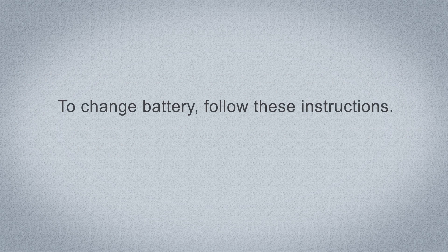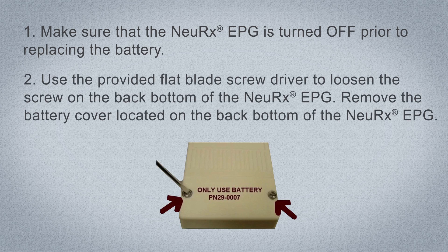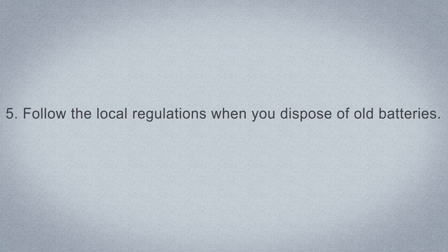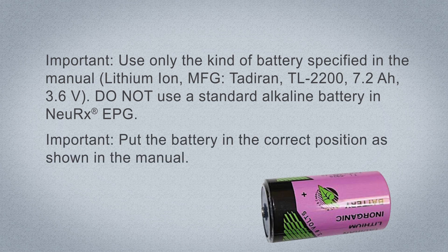To change the battery, follow these instructions. Make sure the Nurex EPG is turned off prior to replacing the battery. Use the provided flat blade screwdriver to loosen the screws on the back bottom of the Nurex EPG. Remove the battery cover located on the back bottom of the Nurex EPG. Remove the old battery and replace it with a new battery. Replace the battery cover and secure with mounting screws. Follow local regulations when disposing of old batteries. Use only the kind of battery specified in the Patient-Caregiver Information and Instruction Manual — do not use a standard alkaline battery. Be sure to put the battery in the correct position.